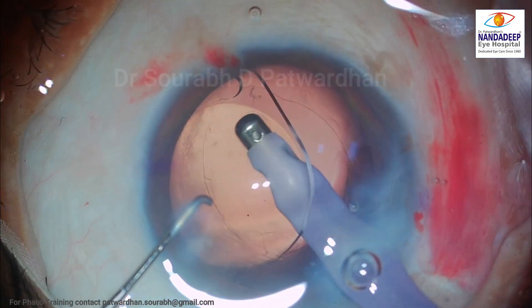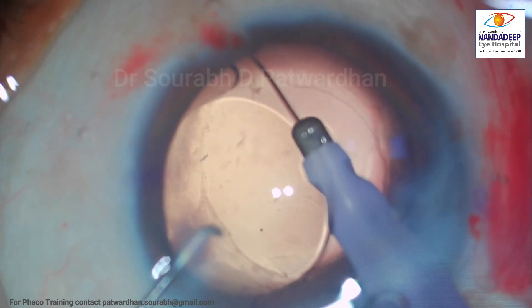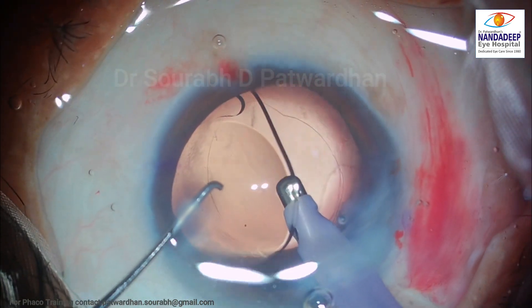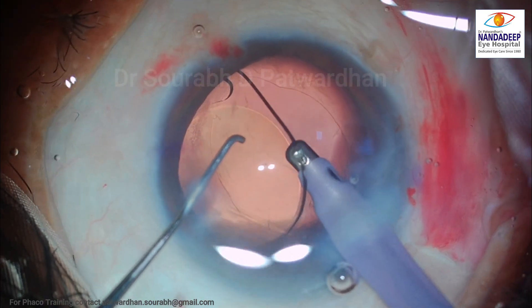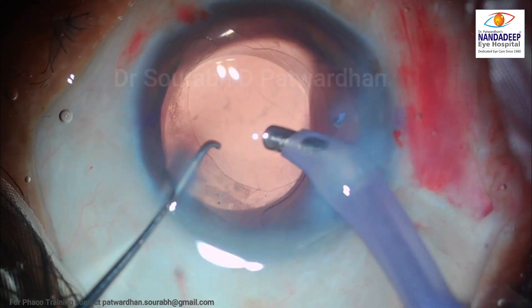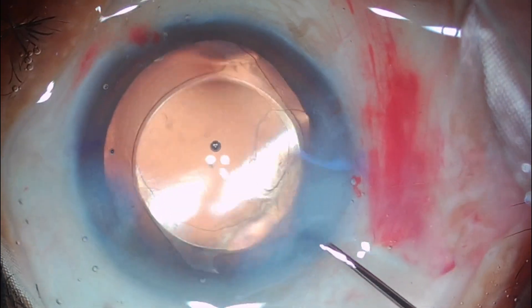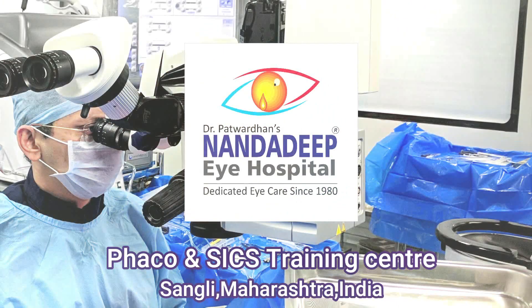The important tip was to rotate the IOL when it is completely unfolded. And in this case, it was a good observation. You will also understand how one should be careful when there is fluid deviation and fluid accumulation in the Berger space. You can see the posterior capsule redundancy in this case very clearly — these are the cases where you have to be very careful with all your maneuvers.